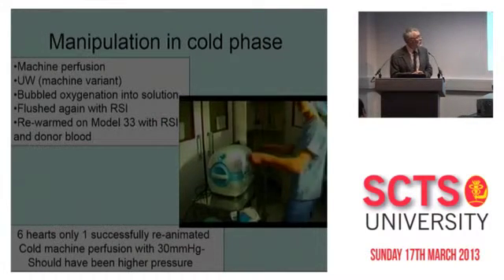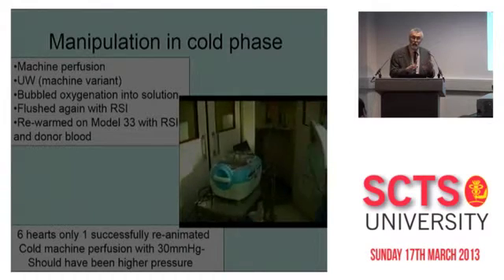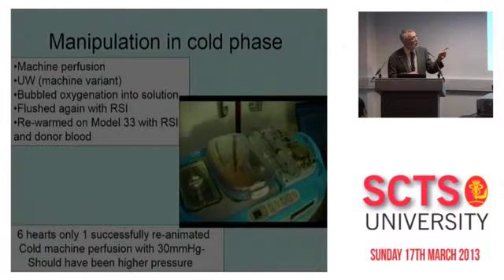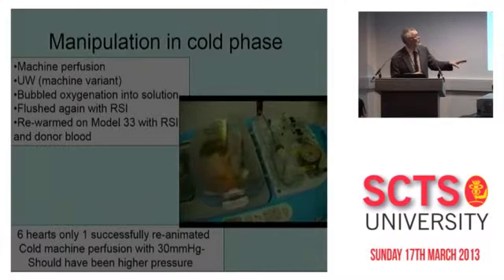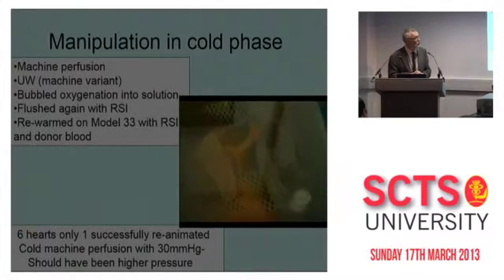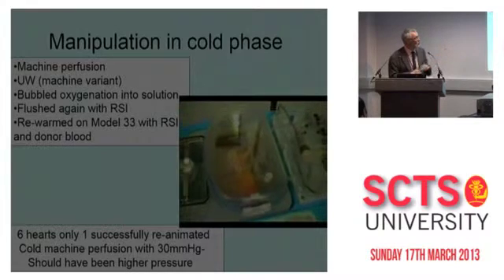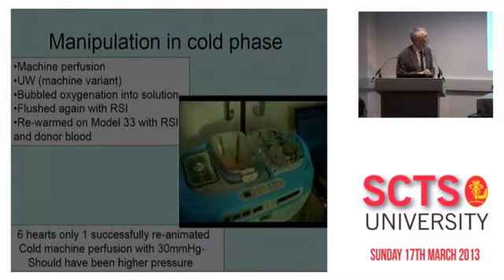So what we decided to do was to try and reoxygenate the hearts in the cold phase after we take it out. So we use machine perfusion. Now this is a cold machine perfusion from a kidney. So we actually just put the heart in it. We used UW, and we actually bubbled oxygen through the solution, and it was very effective. It actually reoxygenated this fluid. And then we rewarmed the heart with RSI and donor blood in our system.